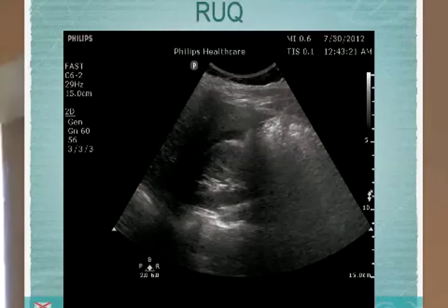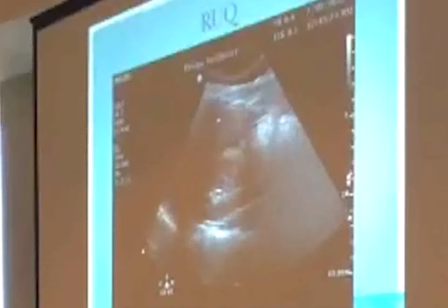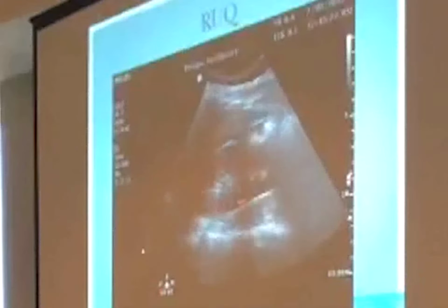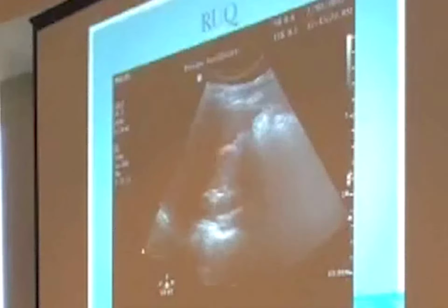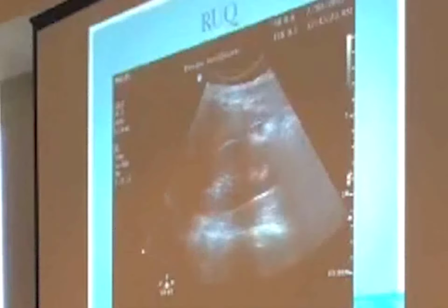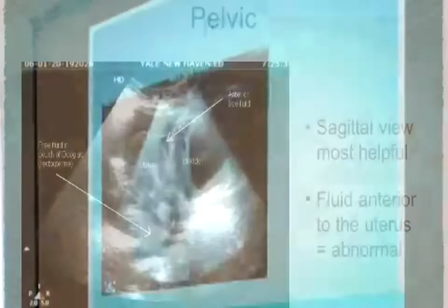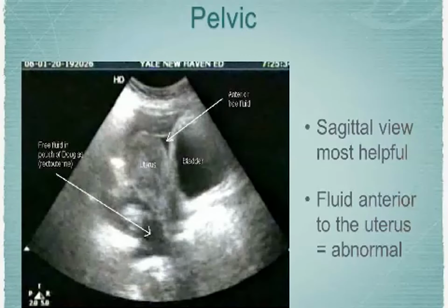It's subtle, right? Remember I talked about looking at the tip of the organs, at the tip of the spleen or liver? See that? That's subtle, but it's real. Here, again, you see something that looks either livery or spleeny. You see something that looks kidney-y, and you see fluid tracking between the crevices that's not supposed to be there. I'm going to keep moving pretty rapid fire. Again, I just want you to see pictures. Look at them and see if you can find the Where's Waldo.